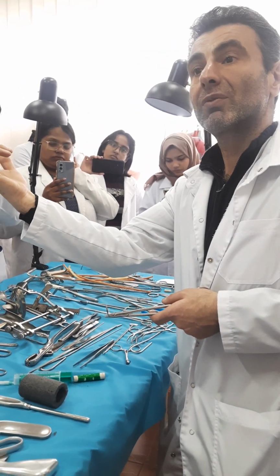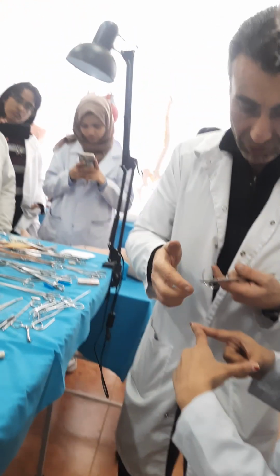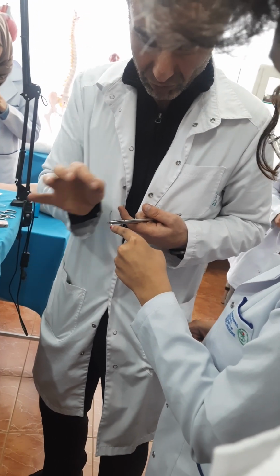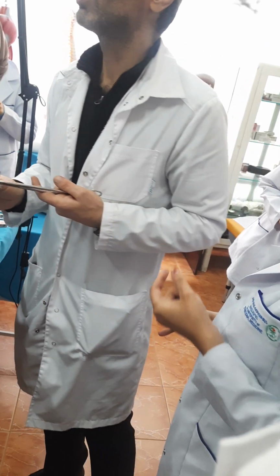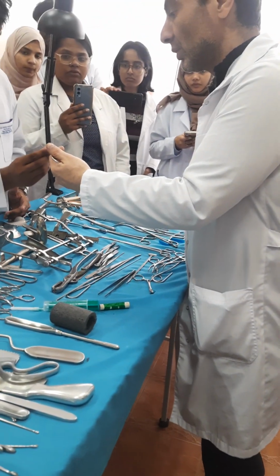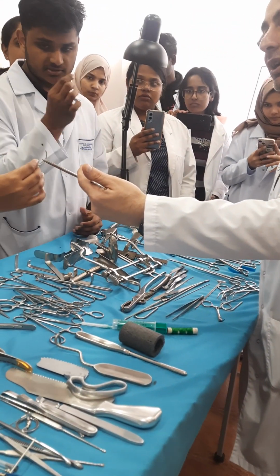Only the tip works. Now please, hold your fingers and tell me, feel this needle. Which form does it have in your opinion? By two fingers palpate it. Which form does it have? Triangle. It has sharp margins. Look. No round body. Sharp margins.